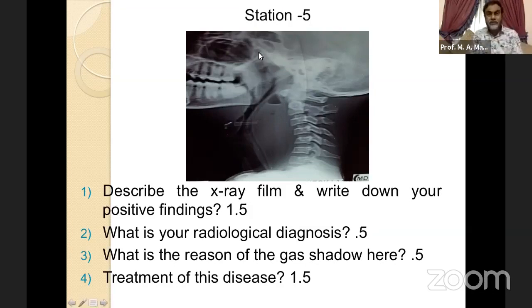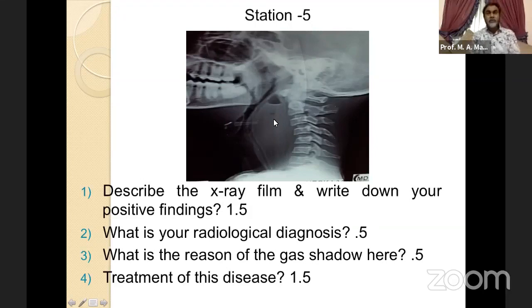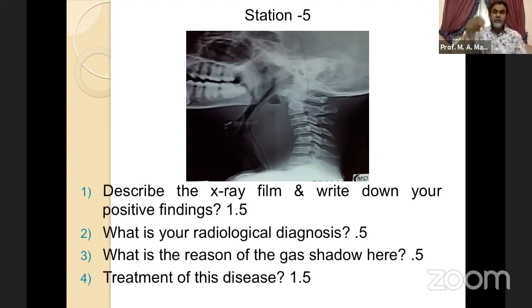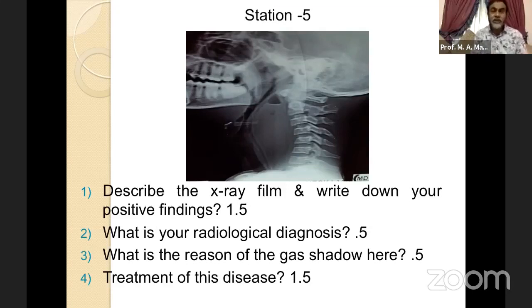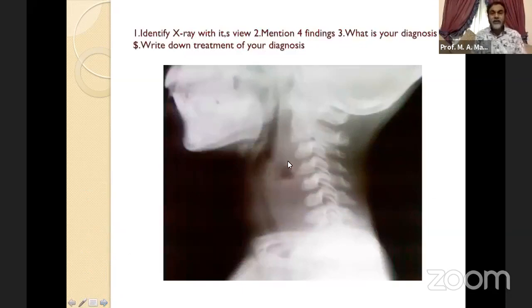The cervical vertebral column is concave or straight due to contraction of the prevertebral muscles. Gas shadow is from gas-forming organisms like E. coli. Treatment: incisional drainage of retropharyngeal abscess without general anesthesia. The patient is kept in the supine position with head down, mouth open with a Boyle-Davis mouth gag. Give a local spray, incise the abscess over the maximum bulging point, immediately tilt the patient head-down and lateral, suck out all the pus, and give intravenous antibiotics and painkillers.